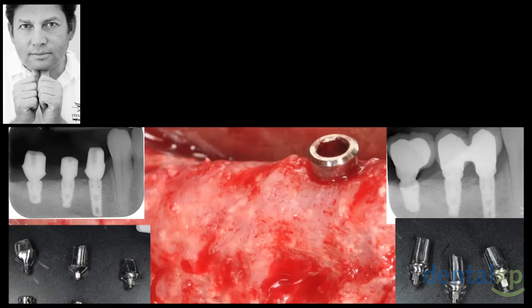And when we look, for example, here, this is after a vertical augmentation we did. You can see in the left picture that the abutment was too emerging. That will lead to compression of the soft tissue. The abutments are there, they are digitally made, but we have to follow another contour. We call this today digitally induced disease, because the computers are limited. I spoke with my lab technician and he said, man, I did it with the computer. I said, yeah, but the emergence profile is not good.